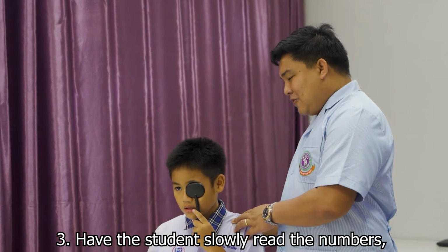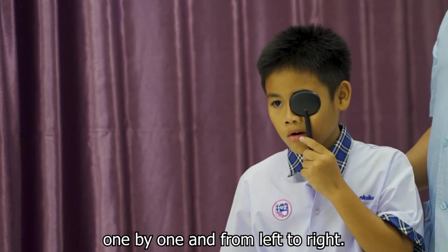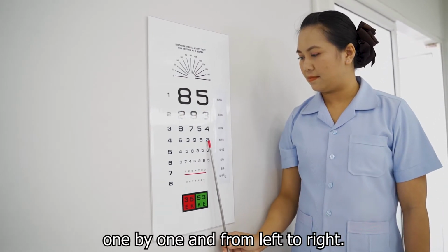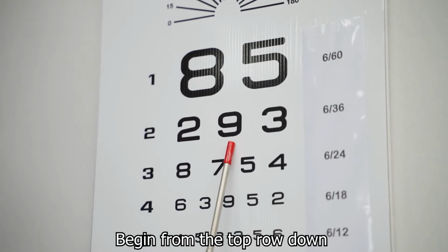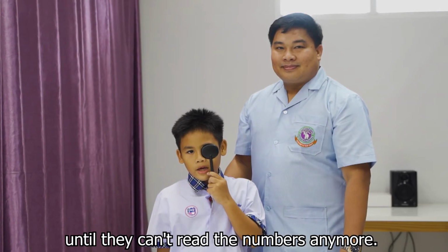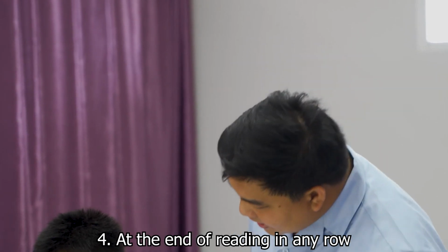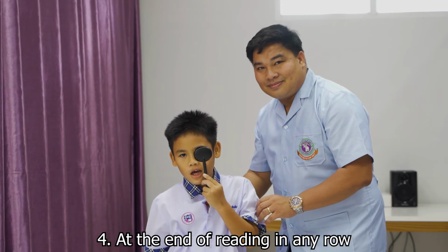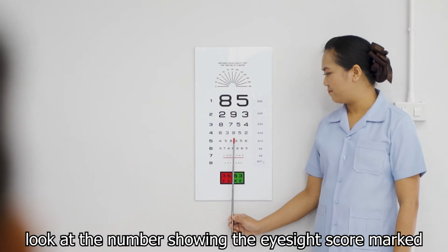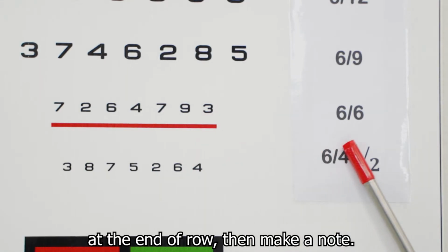3. Have the student slowly read the numbers, one by one, from left to right. Begin from the top row down until they can't read the numbers anymore. 4. At the end of reading a row, look at the number showing the eyesight score at the end of the row.